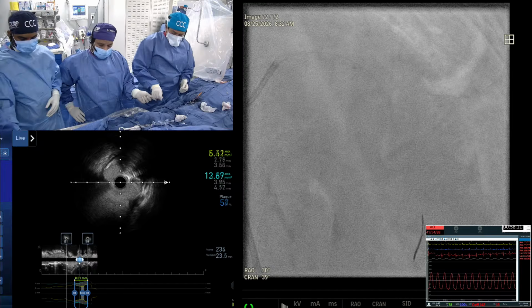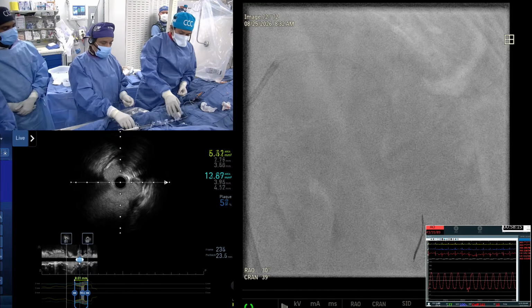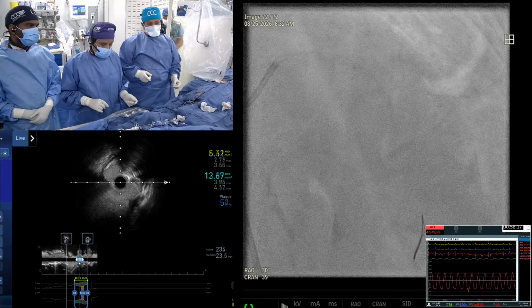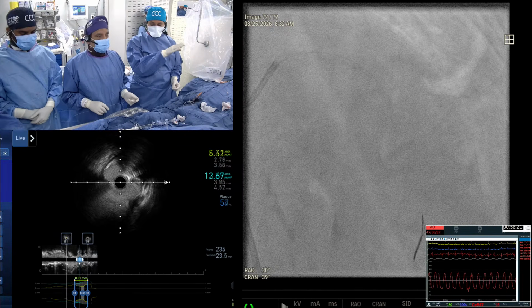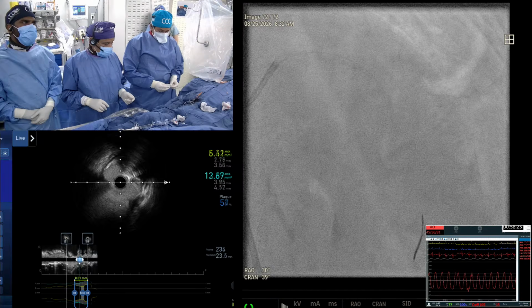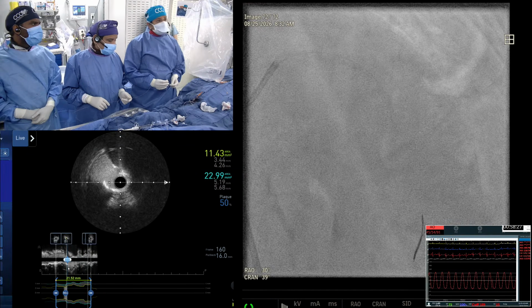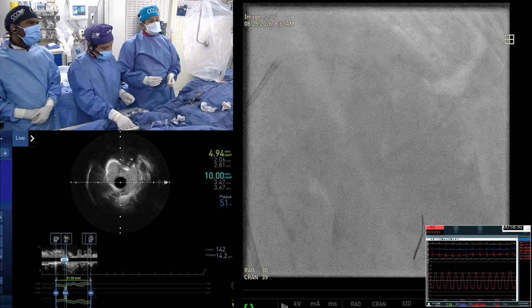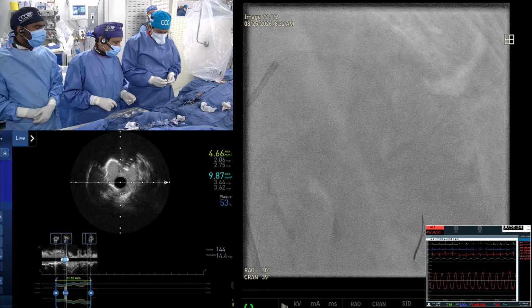That's number one. And a cutting balloon is probably a no-no even in our algorithm when you have a 360-degree arc of calcium on the imaging, as well as if you see tram track calcium; the cutting balloon is probably not ideal. But can we use IVL? We can use IVL. It is just, would it deliver?